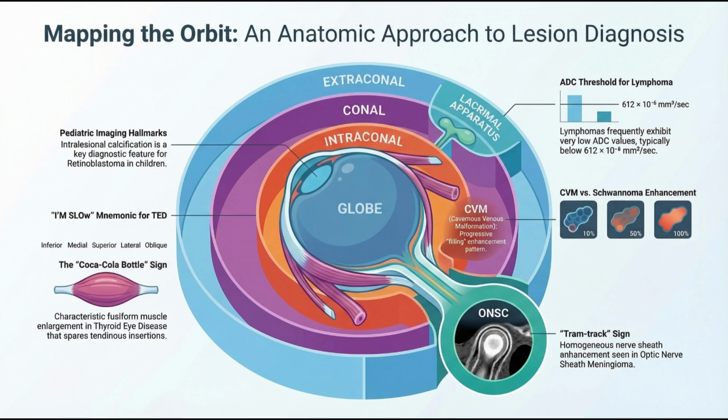This is an inflammation of the optic nerve that causes sudden, painful vision loss. And the source specifically highlights a strong connection between that inflammation and multiple sclerosis. It does. But how does a doctor know it's MS just from looking at a scan of the eye? I mean, it's just a picture. Well, when a radiologist looks at an MRI of a patient with suspected MS-related optic neuritis, they're looking for a very specific geographical signature along that cable. What does it look like? Typically, the inflammation is unilateral, meaning it's only affecting one eye, not both.